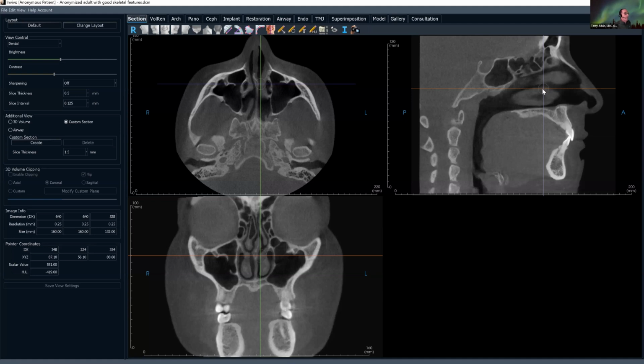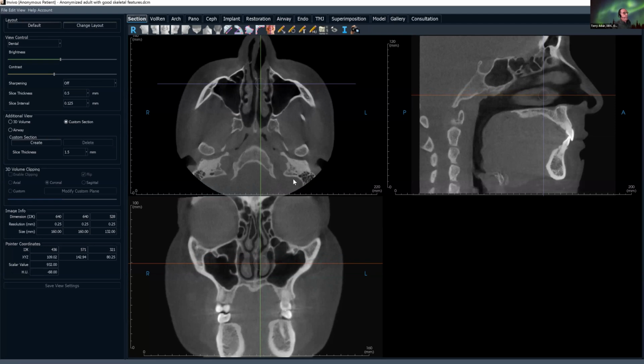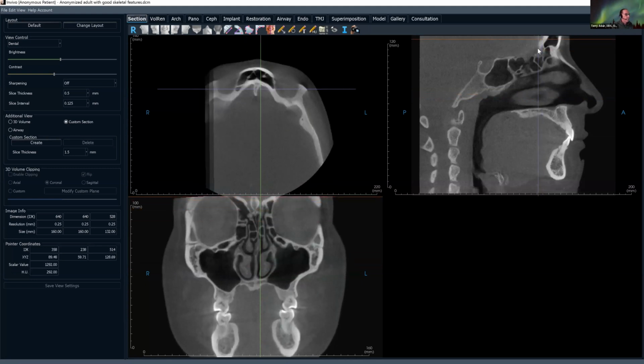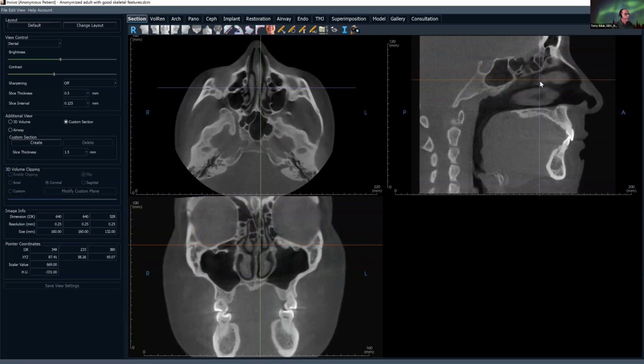your volume. So we scroll through, again, we're looking at the carotid canal. The jugular vein is nearby. Sometimes it's very distinguishable, sometimes it's not. It's probably the most anatomic variant structure that we look for in the skull base. And at the same time, we see the superior aspects of the condyles. So we've gone through this part of it. And for efficiency, what I try to do is hang on to these crosshairs. So when I'm doing this, I literally scroll just like this. And I can see all these structures kind of roll out in front of me.